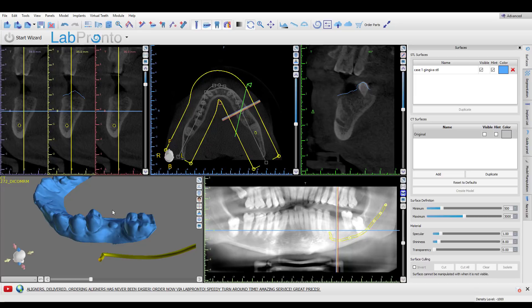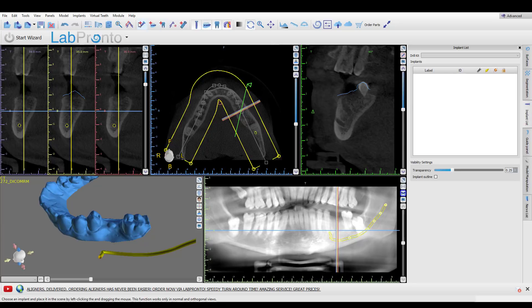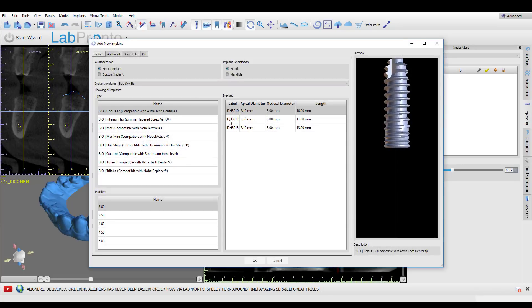One of the most common questions I get is: 'Hey, I use such and such implant, it's not listed in the software — how do I go about making a surgical guide using their drills or their guided surgery kit?' The first answer is you might want to just check first, because many of the implants have been added to Blue Sky Plan.